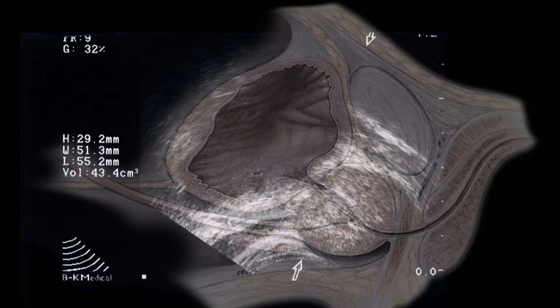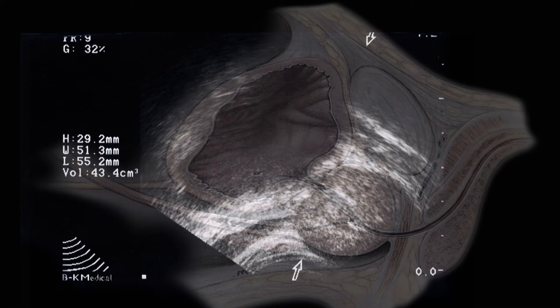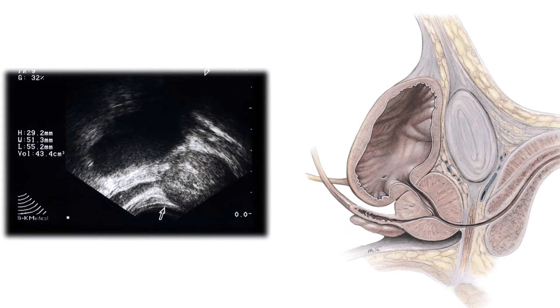The patient has been prepped with ciprofloxacin ahead of time and often an oral relaxer medication. On the ultrasound and the corresponding depiction of the anatomy, you can see clearly the prostate, the bladder, and finally the seminal vesicle.